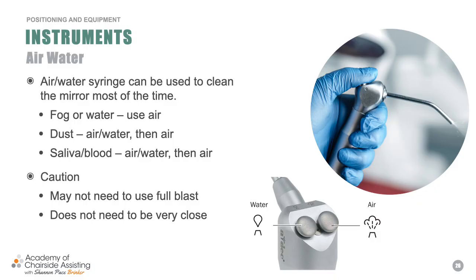When you use a blast of air and water, it makes common sense. It's going to remove everything really, really fast. But sometimes we don't need that much air on full blast, which is why I'm going to give little light spurts of air, okay? And so the air water syringe is really connected to the dental unit, and it's going to provide air and water, and sometimes, like I said, that combination, okay?